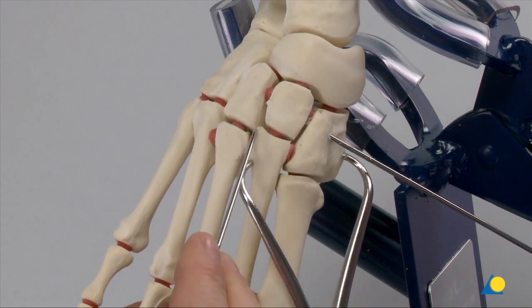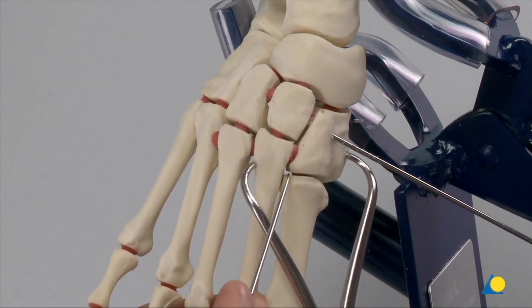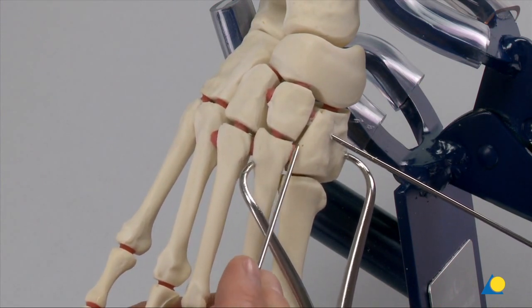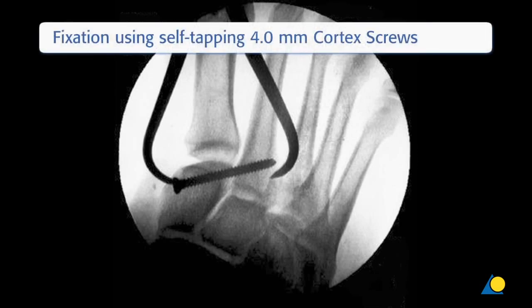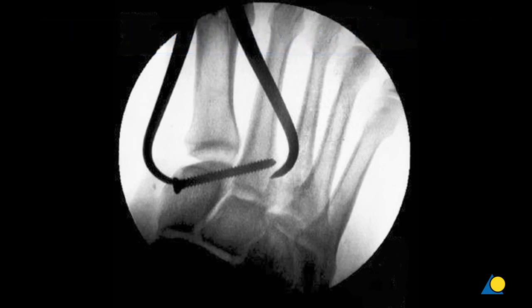It can be seen that the base of the second metatarsal has been seated into this keystone corner. The next step will be to fix the reduction with a self-tapping cortex screw inserted as a lag screw from the medial cuneiform to the base of the second metatarsal. This screw has a 4.0 mm thread diameter and a 2.9 mm core diameter.